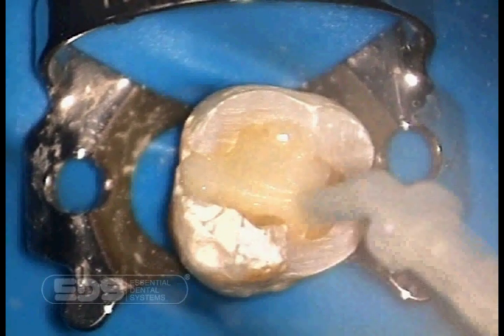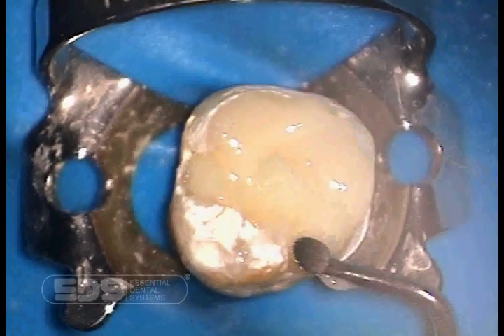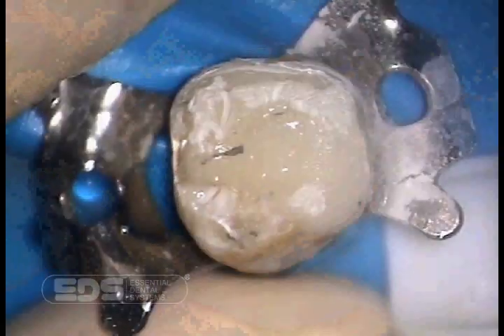Tycor Auto-E is dual cured. It will light cure in 4mm increments in 20 seconds, or will self-cure in 6 minutes. Adjustments can be made to the material before it has set. We now light cure the material between 20 and 40 seconds. We remove the excess material using a coarse diamond drill, making a rough preparation for the core. The tooth is now ready for crown preparation.